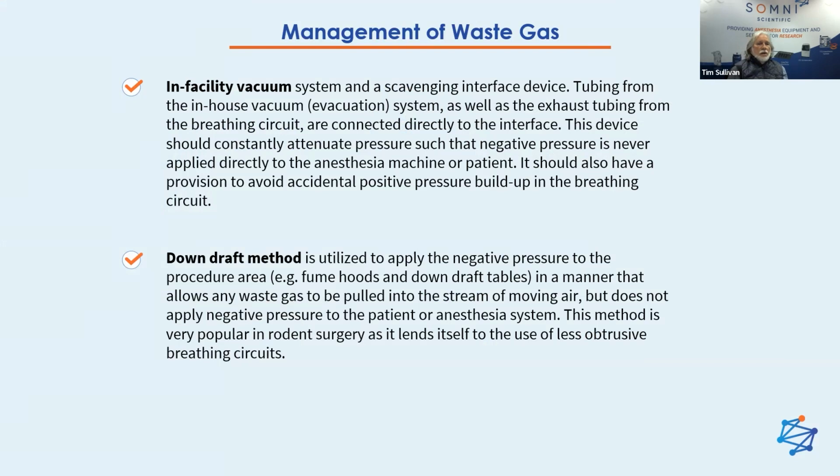Another system that is used in facilities is a snorkel type system. It's typically a large flexible hose with a negative flow created by some kind of a suction fan, in-house suction fan or something.